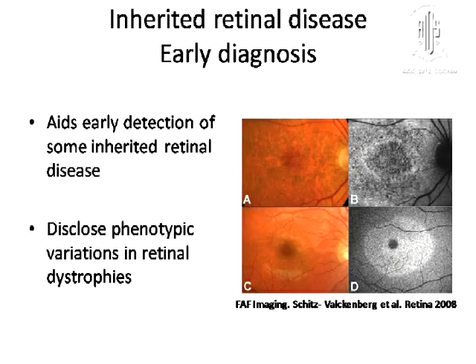Other inherited retinal diseases, autofluorescence helps us towards early diagnosis. For instance, if you look at family members, say for instance this is a patient and this is an autofluorescent image, but this is a family member. When you look at the color photo, it looks almost normal, but if you take an autofluorescent image, you show that this patient is developing the disease, which may show up in the subsequent years. So for early diagnosis, autofluorescence can be used. You don't have to do an angiogram or an electrodiagnostic test.